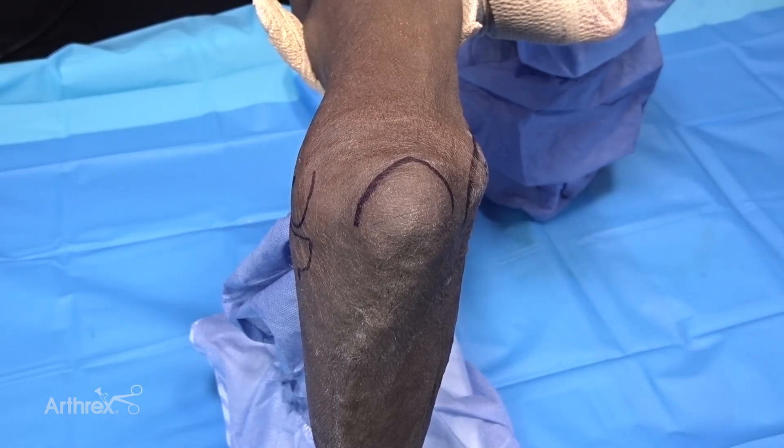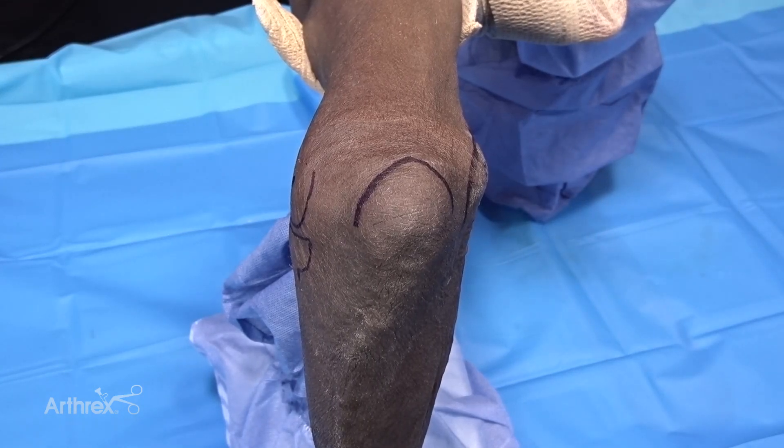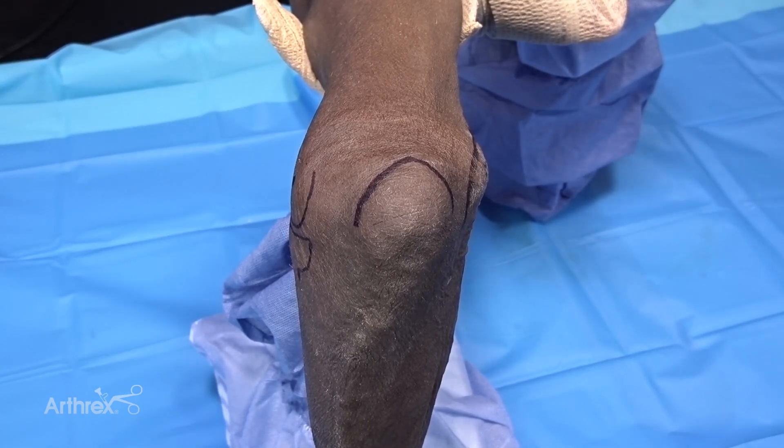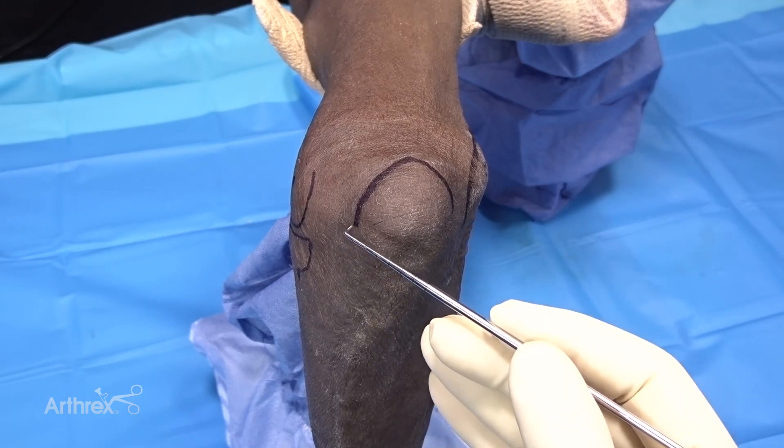For this demonstration we're using an anconeus splitting approach. It's a direct posterior approach to the capitellum.